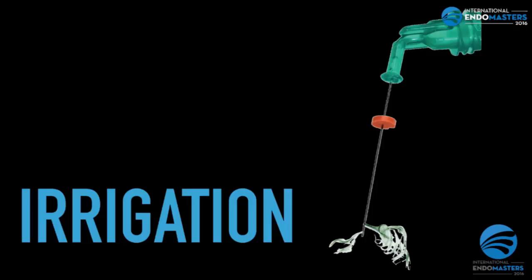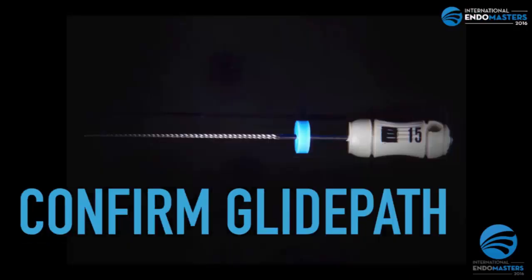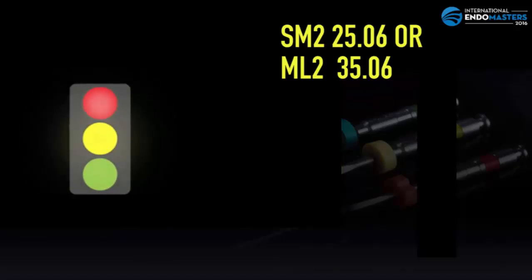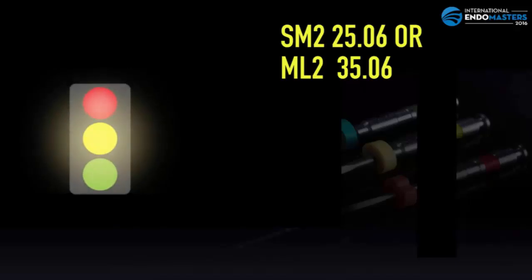Then we are going to irrigate with sodium hypochlorite, and you are going to confirm the glide path with the number 15 hand file. The yellow light signifies continue with precaution or stop.